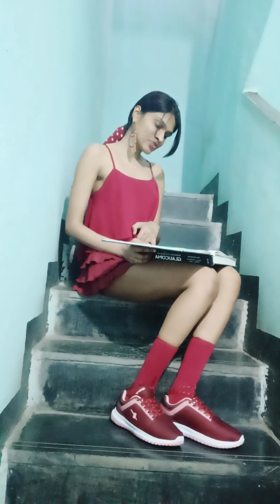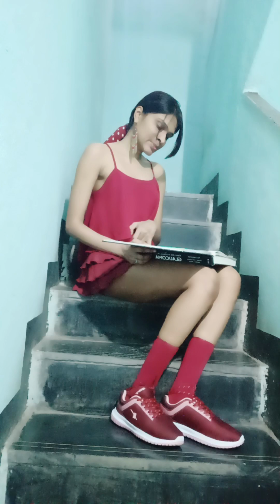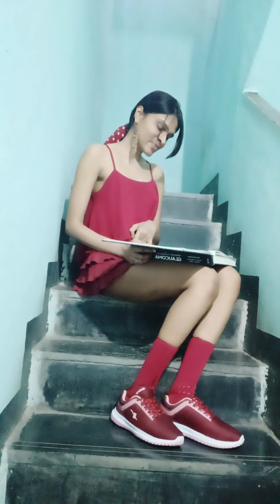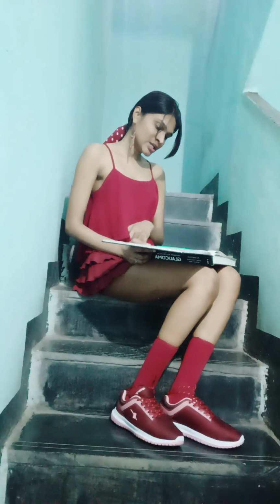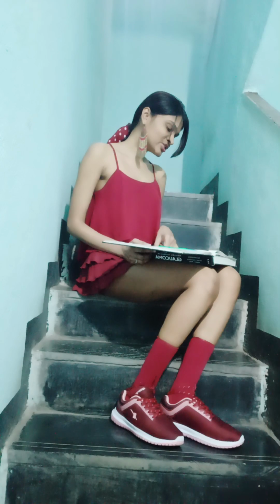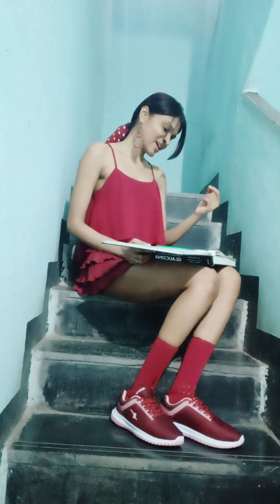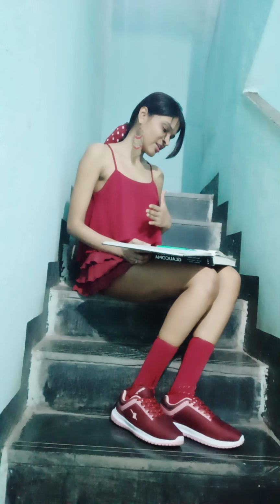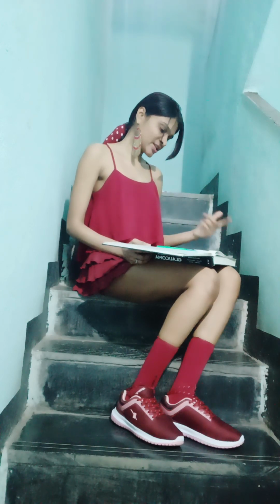The appearance of functional meshwork varies considerably depending on the amount and distribution of pigment deposition. The trabecular meshwork has no pigment at birth, but with age, color develops from faint tan to dark brown, depending on the degree of pigment dispersion in the anterior chamber. The distribution of pigment may be homogeneous for 360 degrees in some eyes and irregular in others. In the functional portion of the meshwork, especially when lightly pigmented, blood reflux in the Schlemm canal may sometimes be seen as a red band.